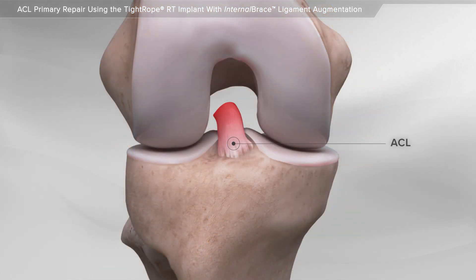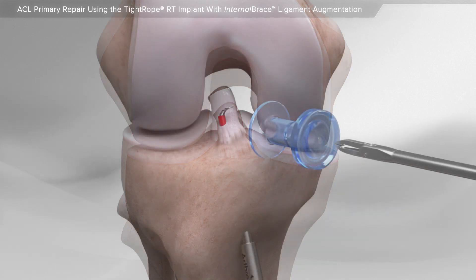Certain types of ACL tears can be repaired, meaning your surgeon can keep the original ligament and reattach it to the bone. If your surgeon determines that you are a candidate for ACL repair, they can perform the minimally invasive surgery using a small camera, special surgical instruments and suture.